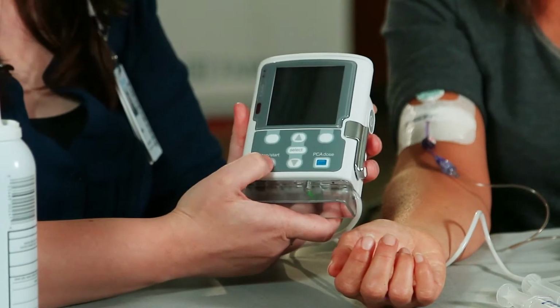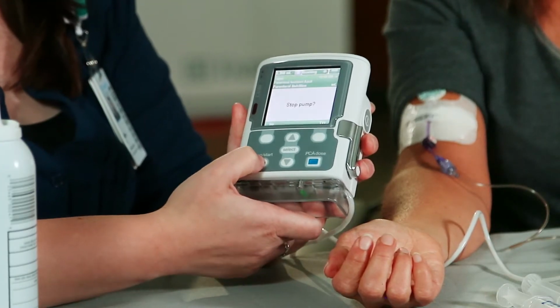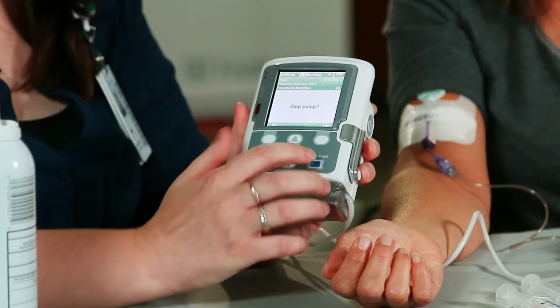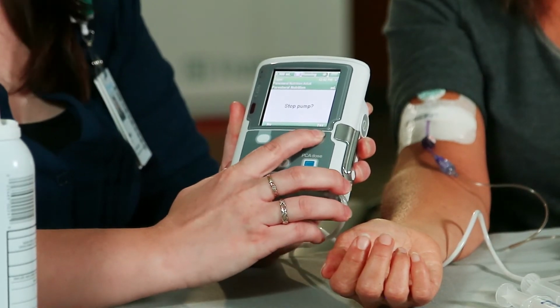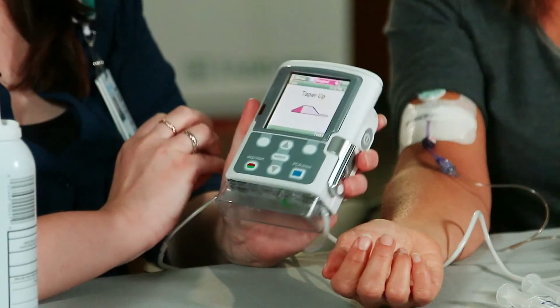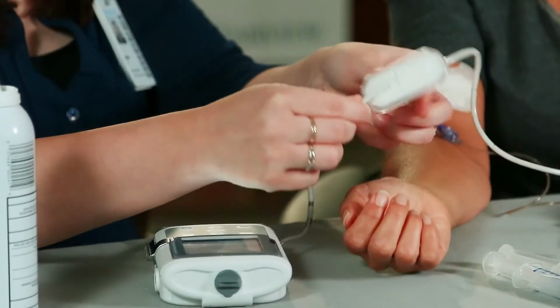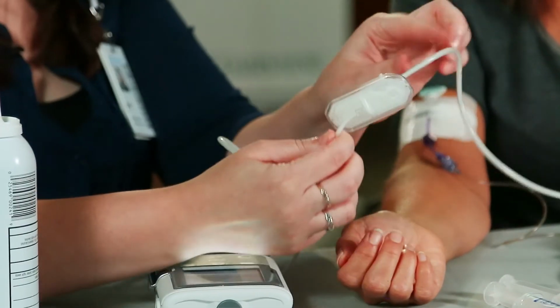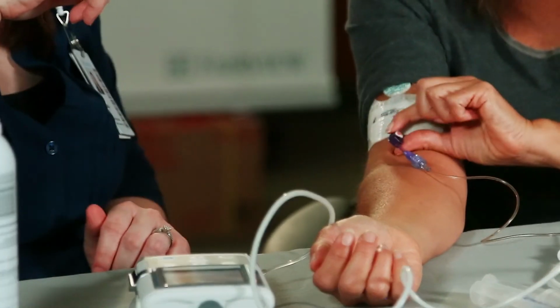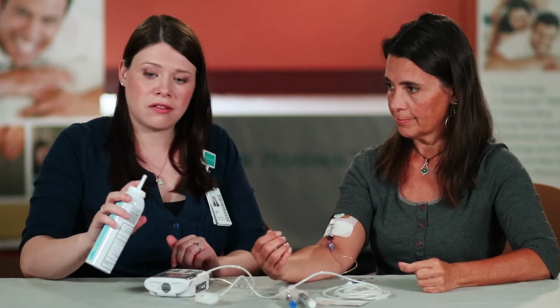To stop the pump, push the start-stop button located at the bottom of the pump. The pump will then ask you, do you want to stop the pump? You want to press the soft key, yes. It will then say pump is stopping. At this time, you want to clamp the tubing and also clamp your PICC line. Now you want to perform hand hygiene.